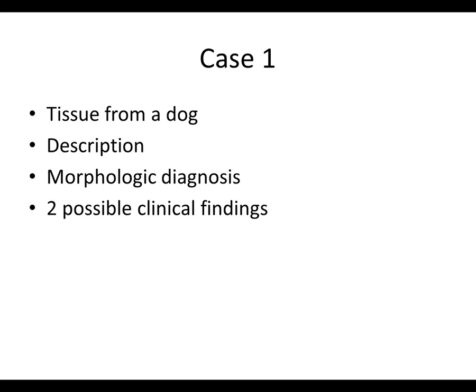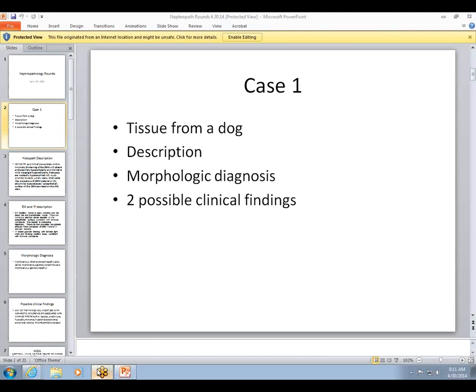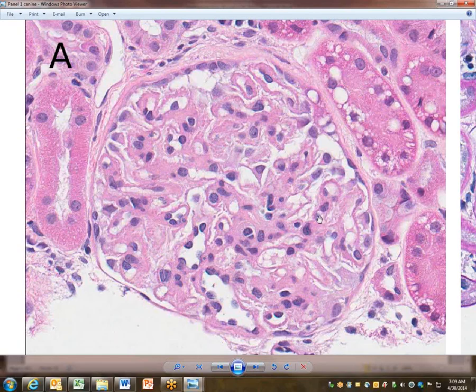That's fine. All right, you should be able to see the H&E panel for the first case. Correct? Yes.